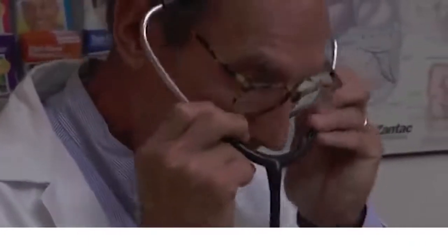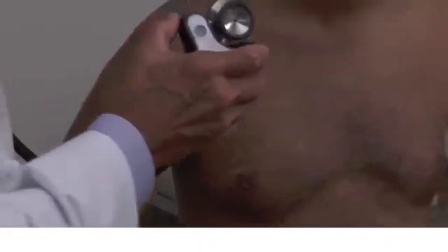Cardio Sleeve not only transcends the limitation of human hearing, but also makes ECG accessible at any point of care.